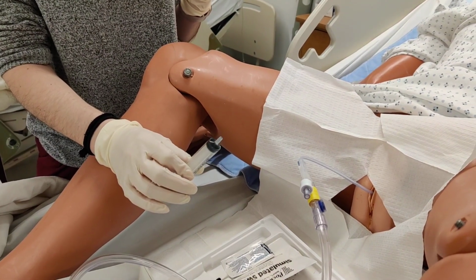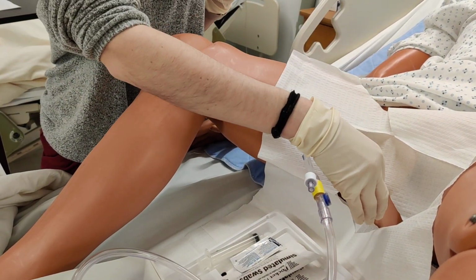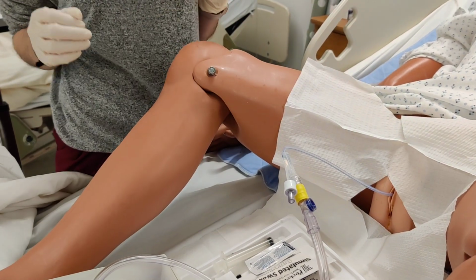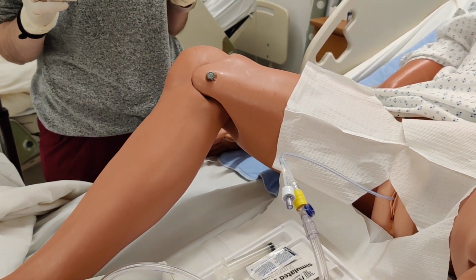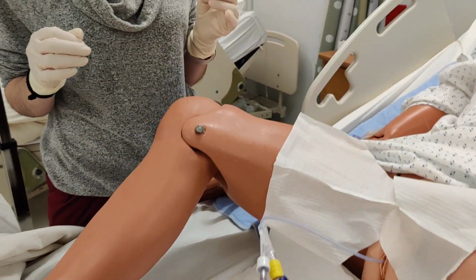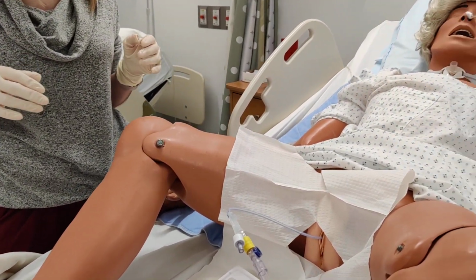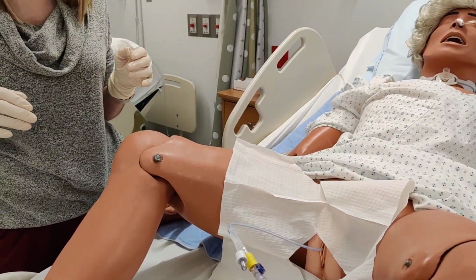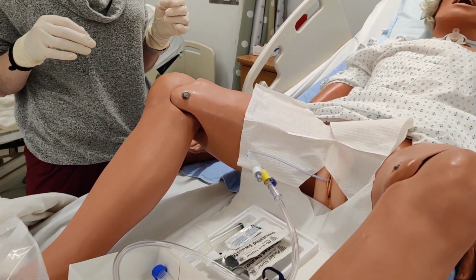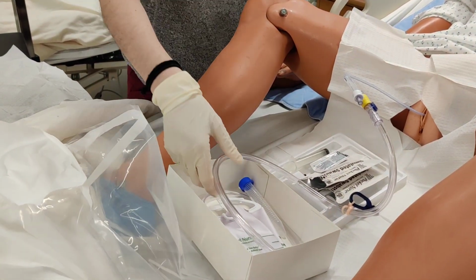Once you have that syringe detached, you can tug a little bit, not hard, just a gentle pull back on the catheter just to make sure that you get a little bit of resistance so that you know that it's sitting in the bladder correctly and it's not going to come out. This procedure should not be painful for your patient. A little bit of discomfort, maybe a little bit of burning, but it should not be painful. Once she has that tug, and she knows that it's in place, she's going to take the Foley bag out of the kit.